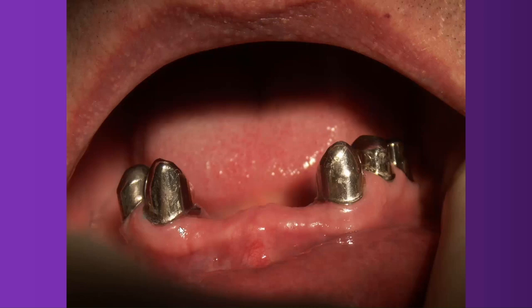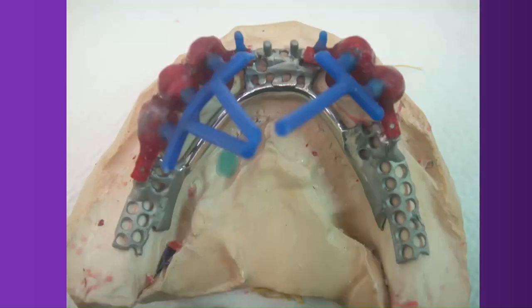So I had a resin key or index to check if they fit perfectly intraorally and on the model. If they fit with the same resin key intraorally and on the model, it means there's no difference between the model and the mouth. You have to check all the time, because small errors can cause the denture not to sit. I was working until 2 o'clock in the night. I wouldn't do that again. But that was that time.